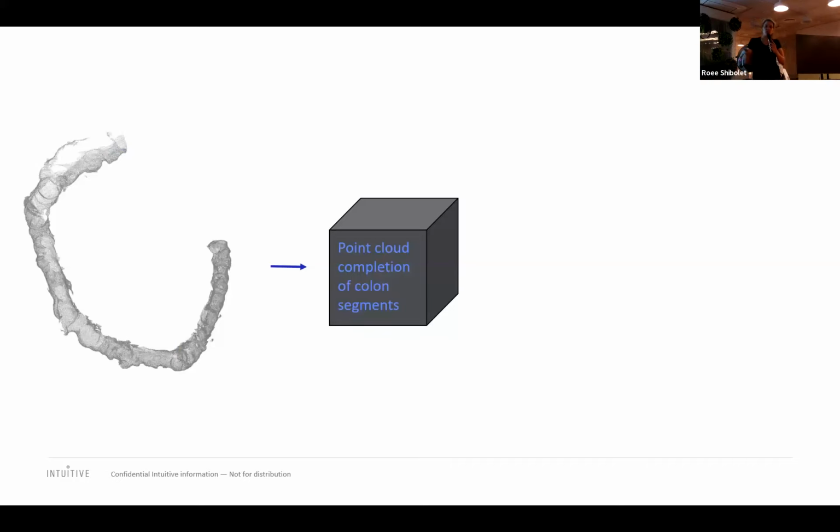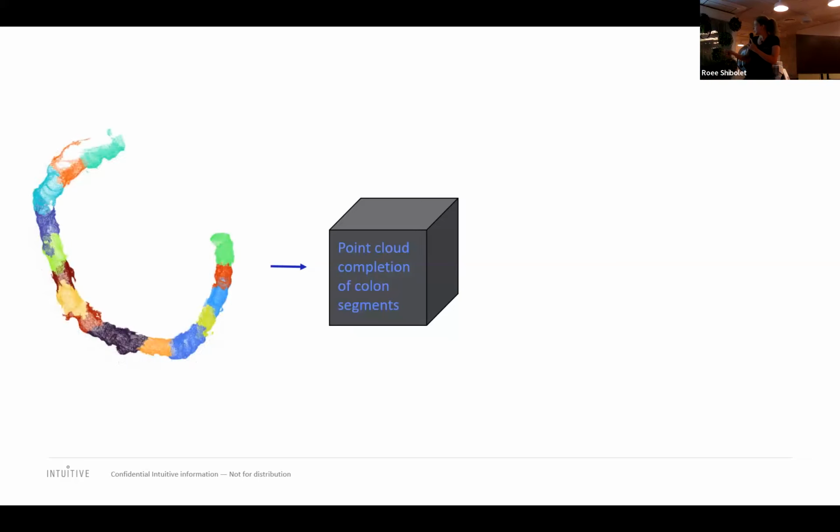So what we can do is to try not to estimate the center line. We can try to use some clustering algorithm, and if we do this, we'll get this kind of segments, which are much noisier than the ones I showed before. You have different sizes, like some very large segment here, a much smaller one here. They tend to overlap a little bit.